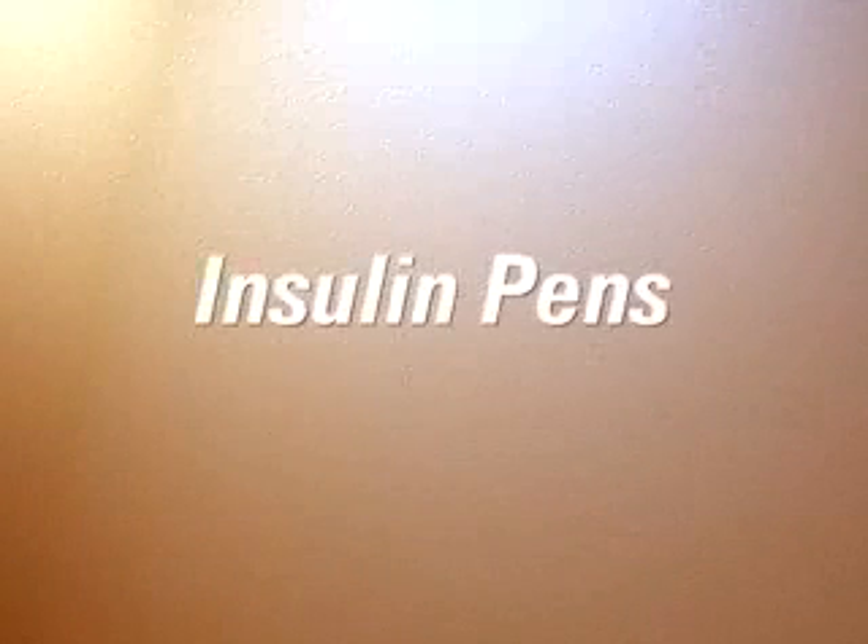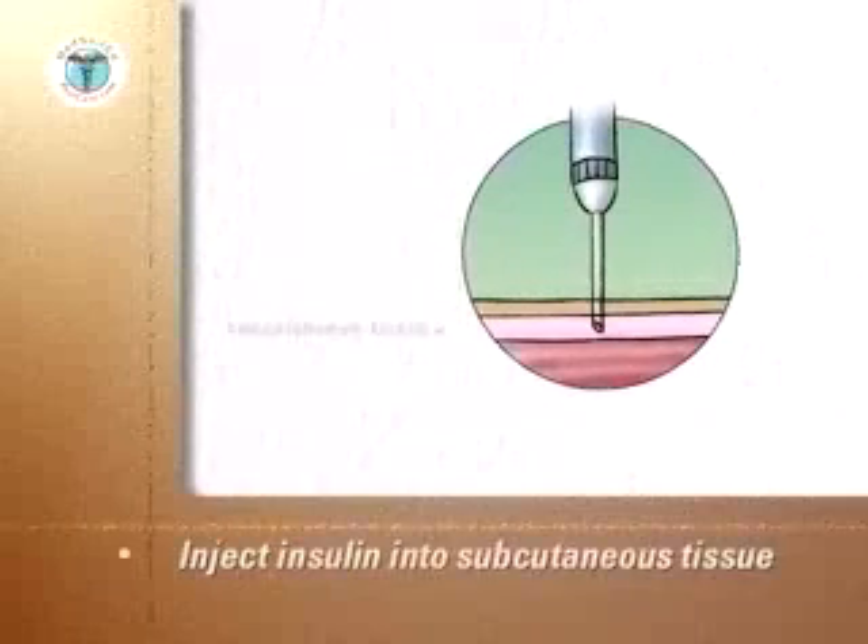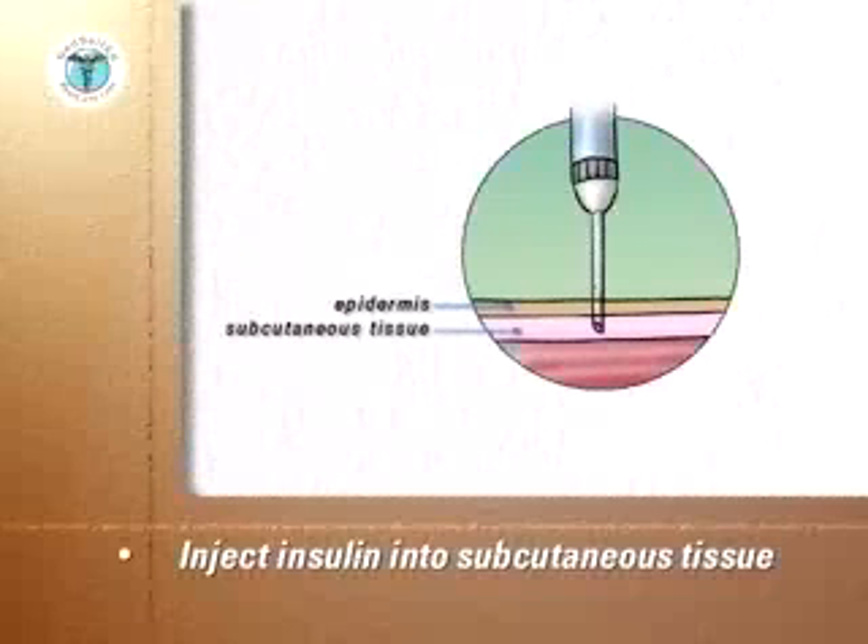This program will demonstrate the use of insulin pens. The goal is to inject the insulin into the subcutaneous tissue between the top layer of the skin, the dermis, and the underlying muscle layer.